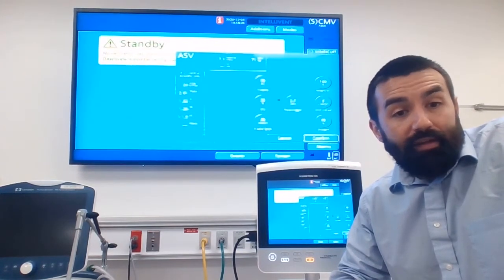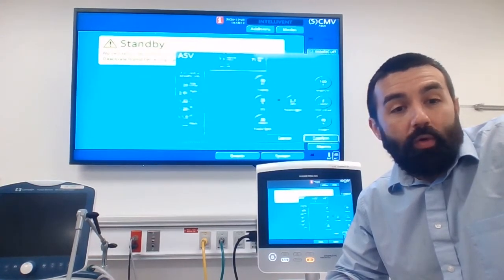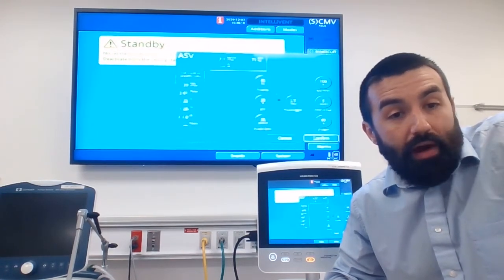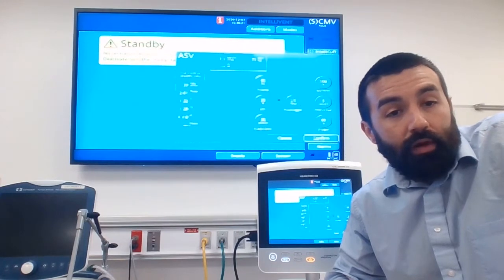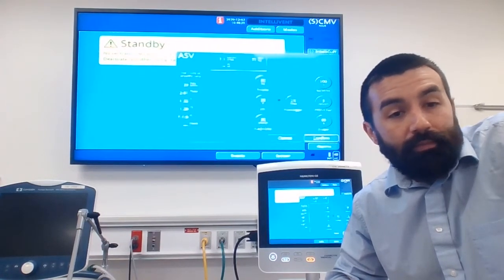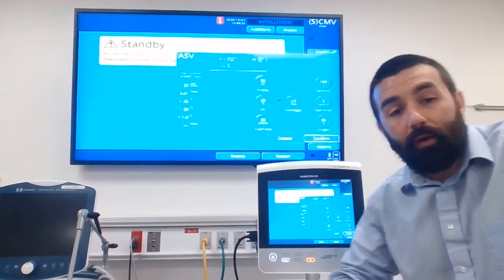So, what is ASV? ASV is IMV, pressure IMV. All right, so really volume targeted pressure IMV. So, what does that mean? When the patient is not actively breathing, they are going to get PRVC breaths. So it's going to target a volume, but it's going to give those as a pressure breath. When you think about it, nothing changes in regards to what you already know about PRVC.